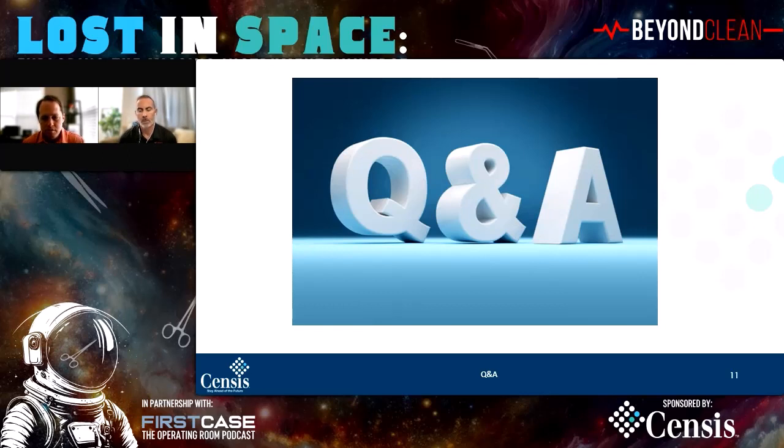Good question. And as you pointed out, it identifies root cause. Time of day, say it's a Monday or Wednesday, it's a different surgeon, same surgical procedure, but it's happening more frequently on a Monday or on a Friday. Whichever, you can really dig into that data to identify those solutions and be like, we're missing more instruments on a given day at this time. And you mentioned you don't want to tell a surgeon that they're doing their job wrong, but you can also say, hey, these instruments are missing a lot during your procedures. And really go from there.